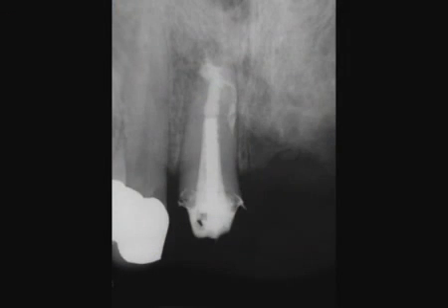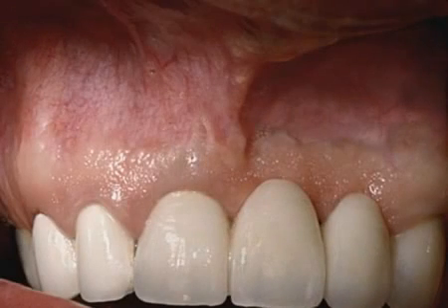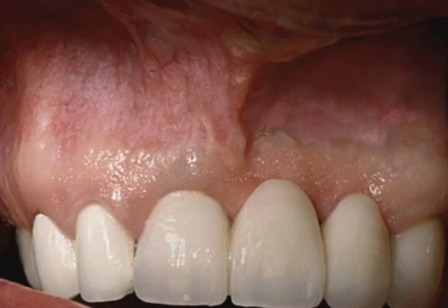After 4 to 6 hours, we can pack the case if the material is brick hard, and a 6-year recall demonstrates the new bridge, post, and the non-surgical efforts and excellent osseous repair. Another photograph demonstrates the restorative efforts. The predictability of this technique is exciting.